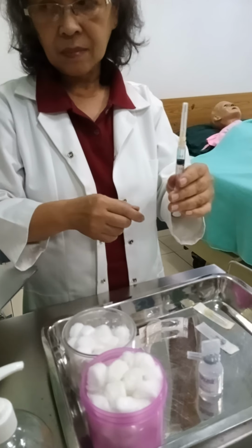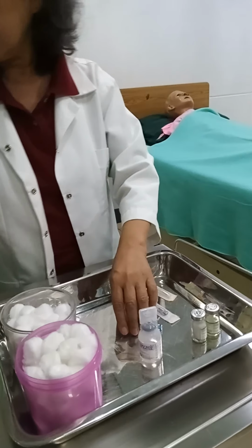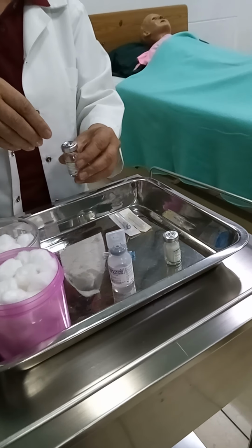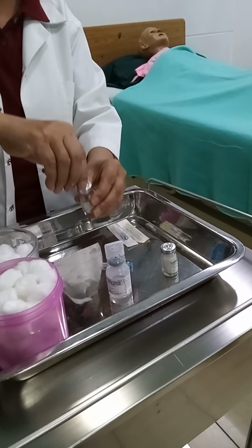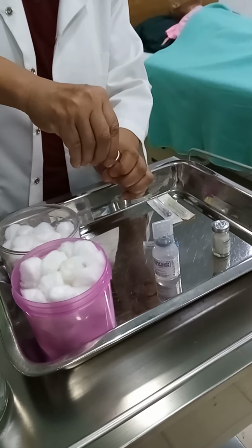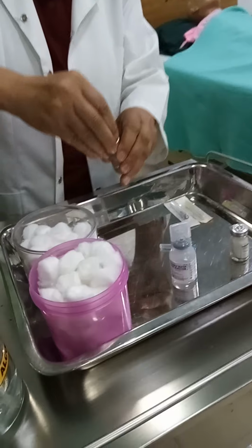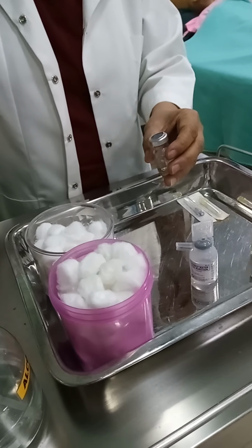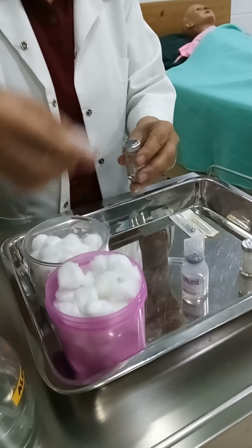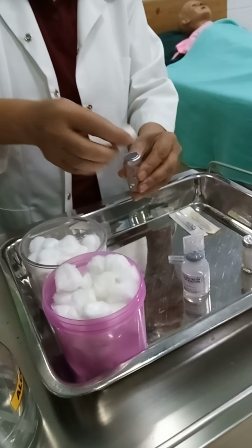Now we go to withdrawing medication from a vial with solution. Remove the cap covering the top of the vial to expose the rubber seal. Firmly and briskly wipe the rubber seal surface with an alcohol swab and allow to dry.